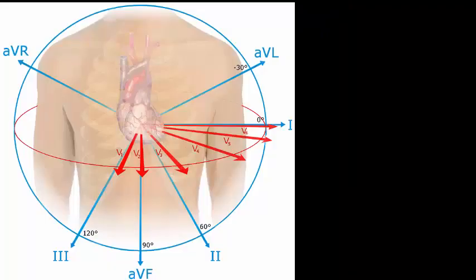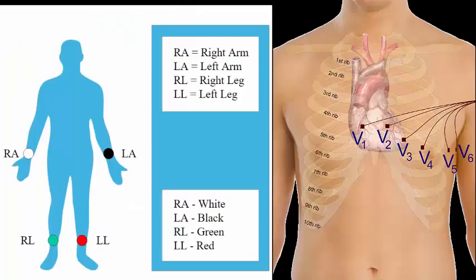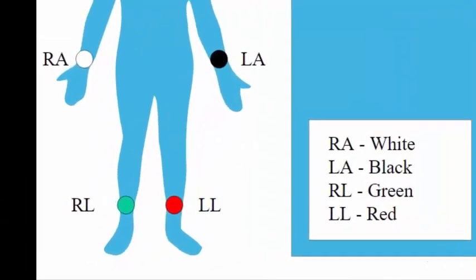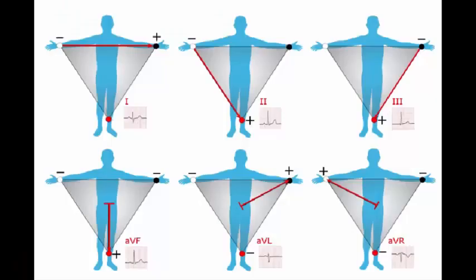The standard 12-lead ECG. The 12-lead ECG is generated from 10 physical electrodes that are attached to the skin. One electrode is attached to each limb and 6 electrodes are attached to the chest. In addition, the left arm, right arm and left leg electrodes are attached to a central terminal acting as an additional virtual electrode in the center of the chest. The right leg electrode acts as an earthing electrode.